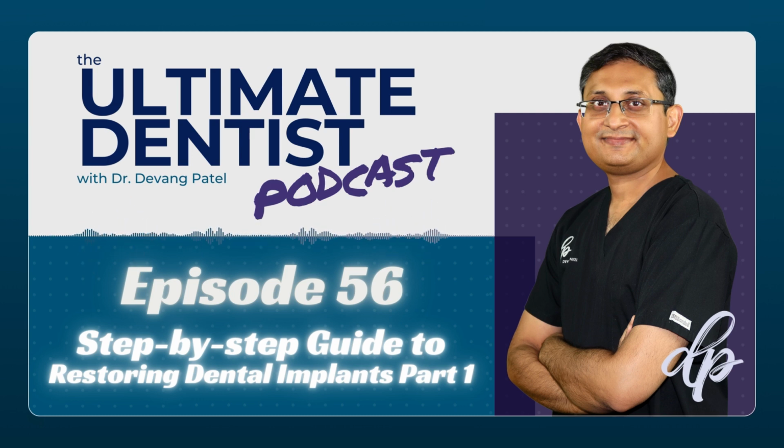The problem with the denture is if he needs a bone grafting in future, I generally don't want the patient to wear denture, because denture will rub against that. Even if you just keep it off the ridge, it will still give pressure from the palatal area. So you don't want denture for those cases. Then the option is Essix retainer with a tooth, like you do Invisalign, and if patient's missing tooth, then you do the tooth. So that's one of the options.